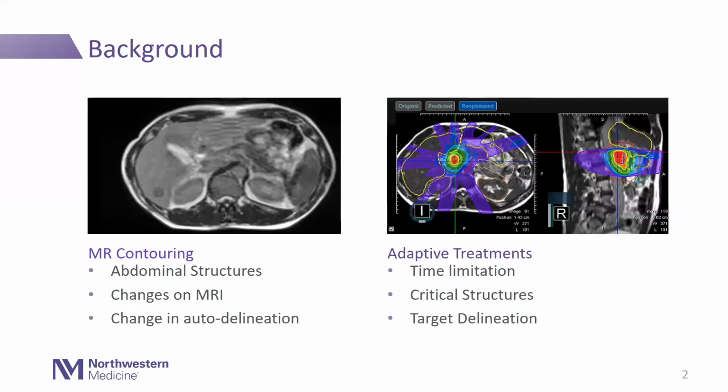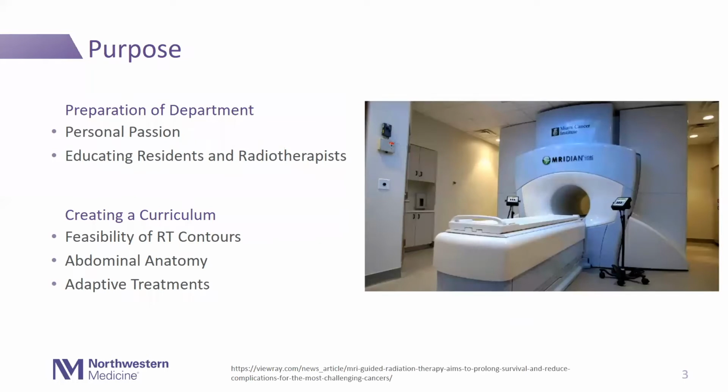Also, it requires a lot of changes for radiotherapists, given the safety that's different. There's different considerations that go into MR fields versus CT-based safety protocols. So overall, the purpose of this project was preparation of our department. It's something I was passionate about, even as a medical student, reading about MR-Linacs. The potential for margin reduction was something I was really interested in. So it's a personal passion of mine. And I also wanted to help educate my co-residents and our radiation therapists and help prepare our department in general to receive and implement this machine.